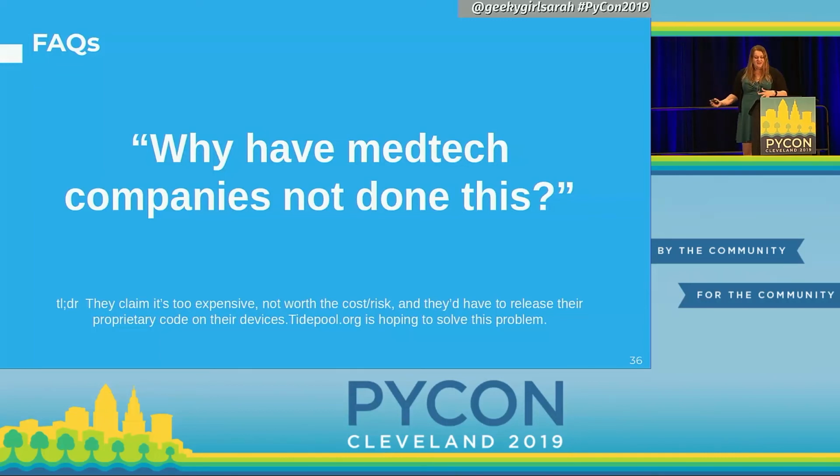I guess we need to release some technology like this. And one company has released sort of a looping system. It's not really great. People keep complaining about how kind of terrible it is. But an organization called Tidepool, which does some data analytics on blood sugar values, has jumped in to say, you know what, we'll be that intermediary. We'll let you keep your proprietary technology, but we want to help enable open source software like this to be able to talk to your pump.